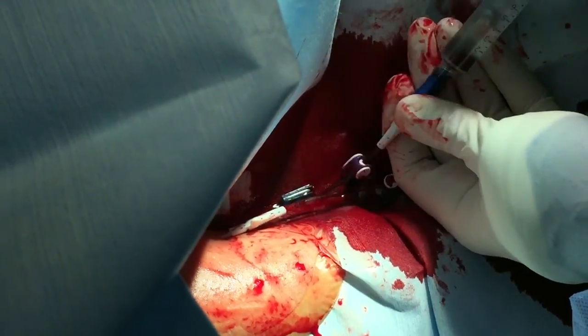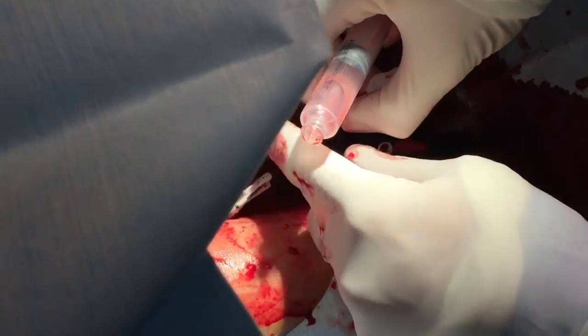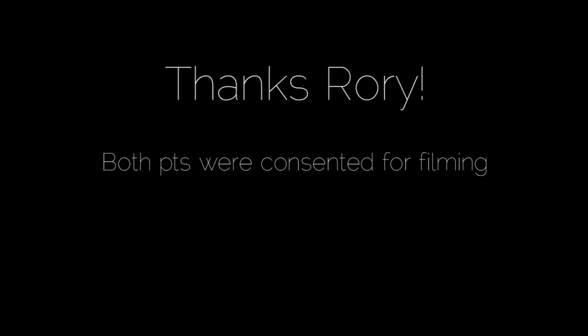We're going to check both ports. There's some nice blood. And it had already been pre-flushed. We're just checking each patency of the lumen. And there you go. So if you have any questions, just put some comments on this post itself, and we'll see them, and we'll get back to you.